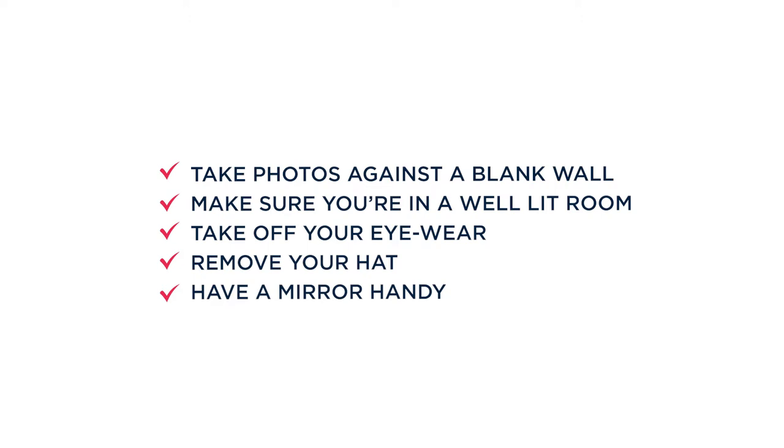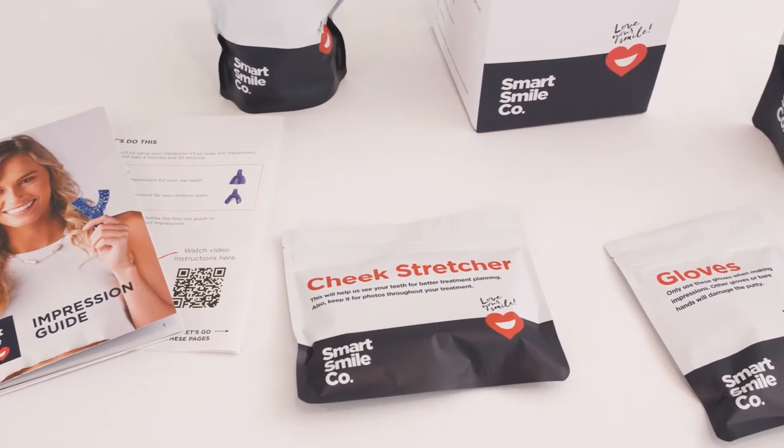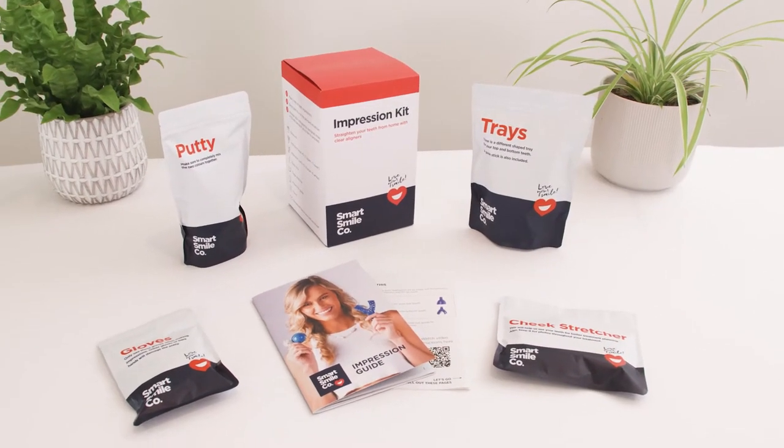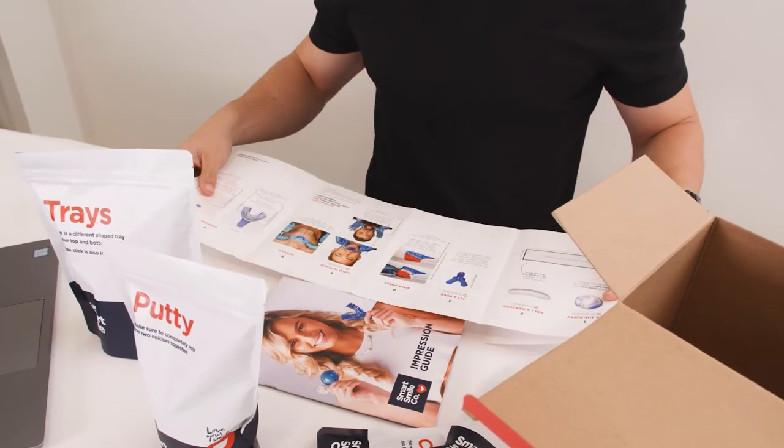To create the best treatment plan, your SmartSmile Co. Orthodontist requires a close look at your teeth. If you have ordered an impression kit rather than visiting a SmartSmile Co. clinic, you need to take eight photos — some standard profile shots and some weirder mouth shots. Watch this video and read your guide to help you take the best photos.